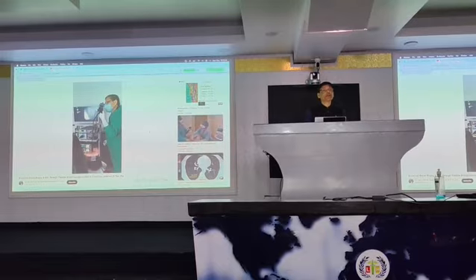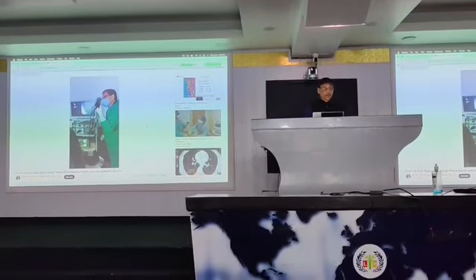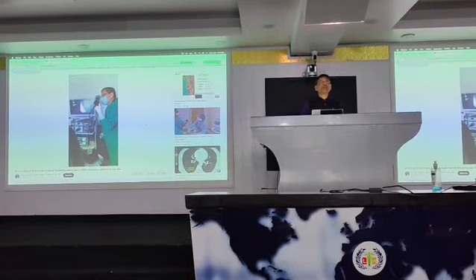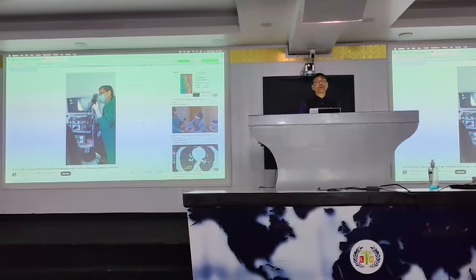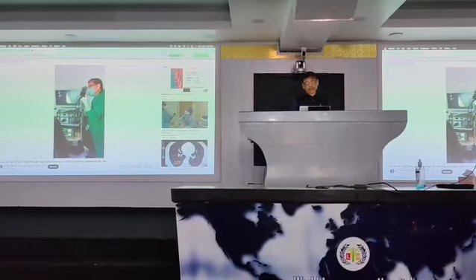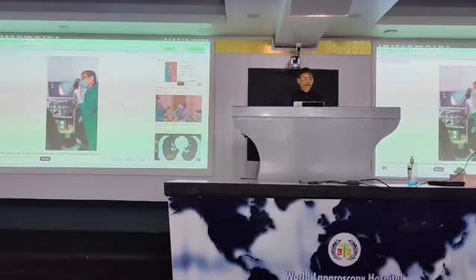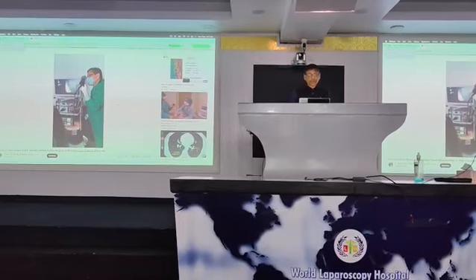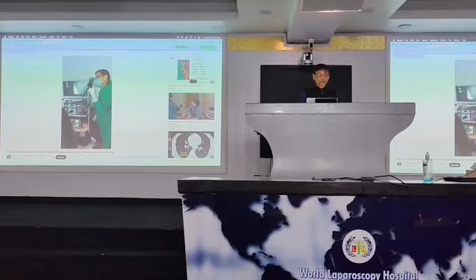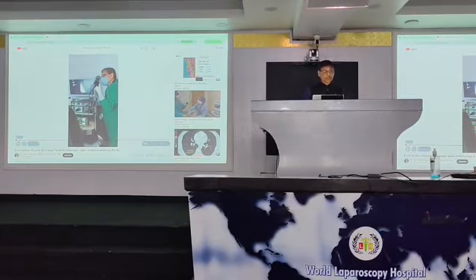And today we learn in this bronchoscopy training program how to take biopsy, brush biopsy, endobronchial biopsy, transbronchial lung biopsy and transbronchial needle aspiration. After that there will be hands-on training. You all will be given a chance to do the procedure. So let us see this video first.